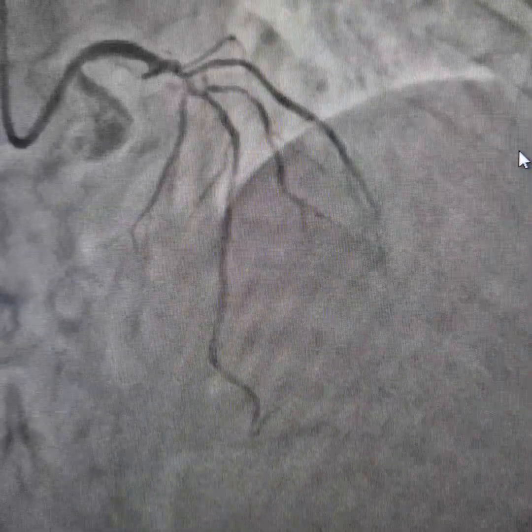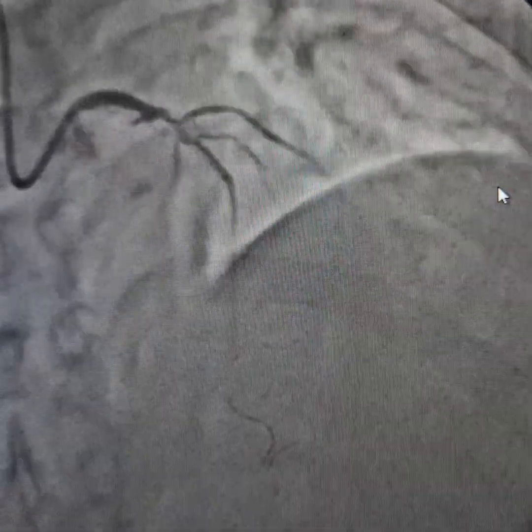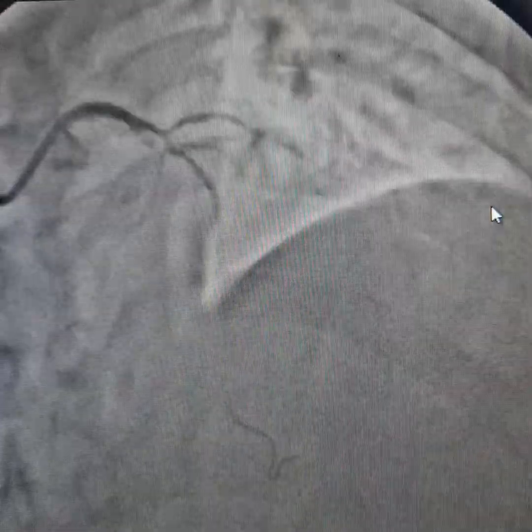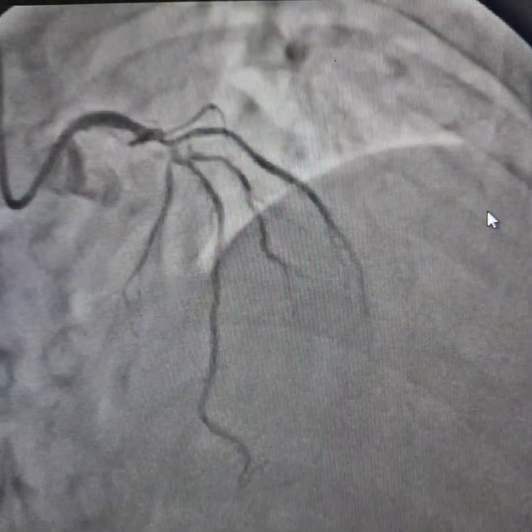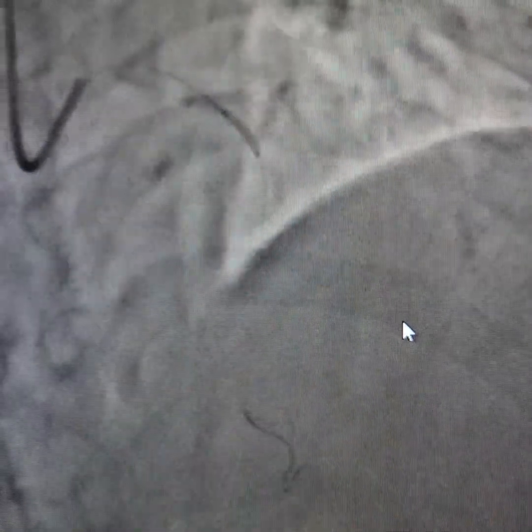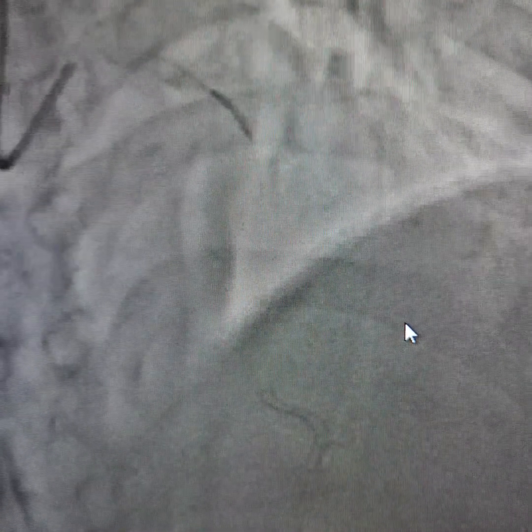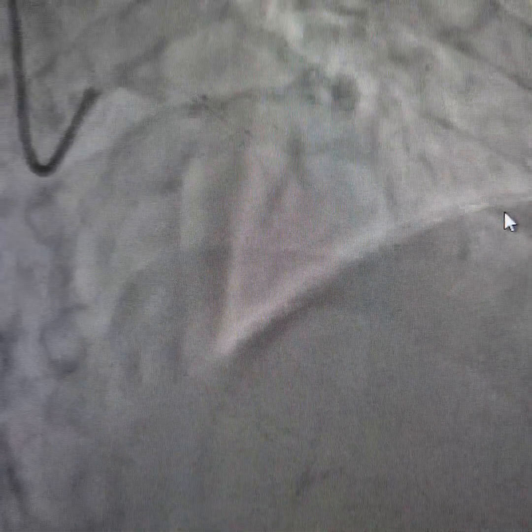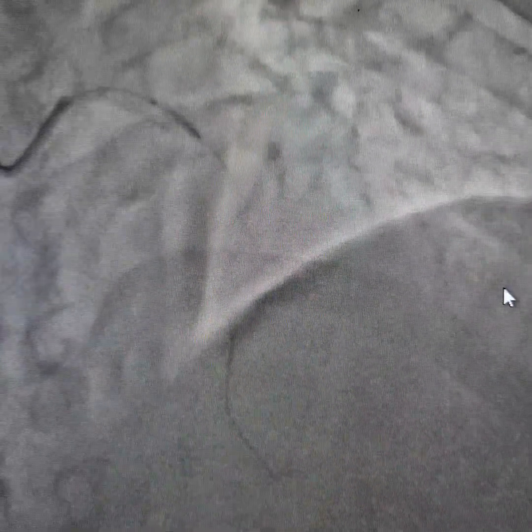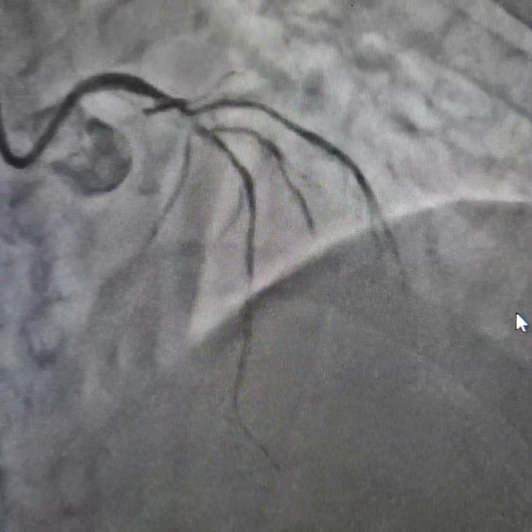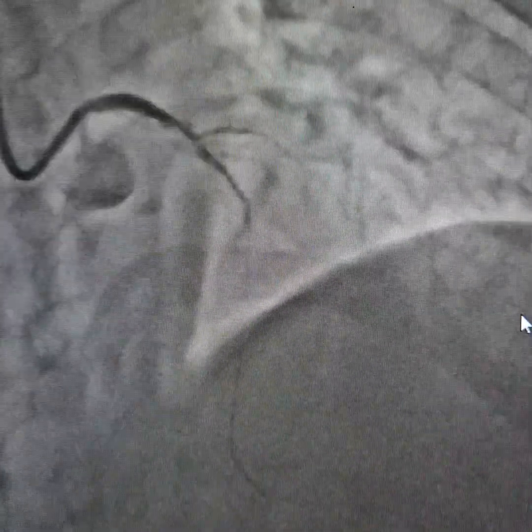You can see that we are trying to pre-dilate the lesion. The calcification is so much that it is posing a real problem here. We are trying to pre-dilate the lesion with a 2 by 10 mm balloon, doing some more pre-dilatation and going up slowly. We could not see the calcium breaking up a lot.